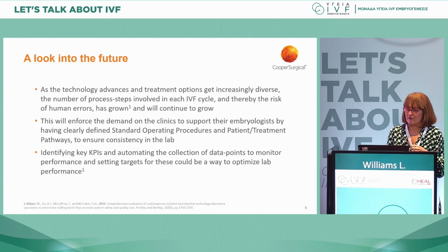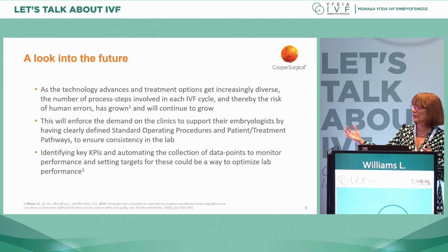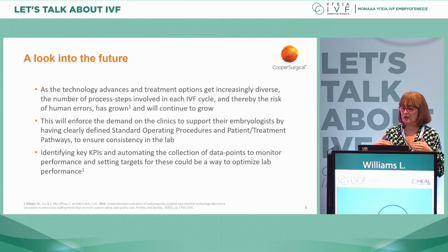We've done a number of polls over the years, and we've identified a number of new challenges that a lot of the clinics have. And these include the drive for greater transparency, driven by patients, especially when you see high-profile mismatched stories in the news. Patients also want to be more involved, to be able to see what's happening. There's a need for customization of treatments. Not everything is the same. Not each treatment program is the same. And obviously, we see an increase of regulatory scrutiny and also the need for reporting.